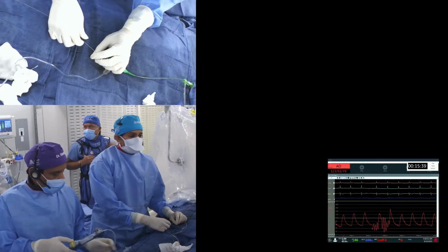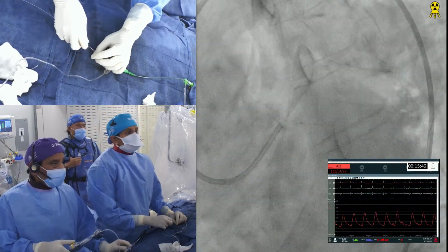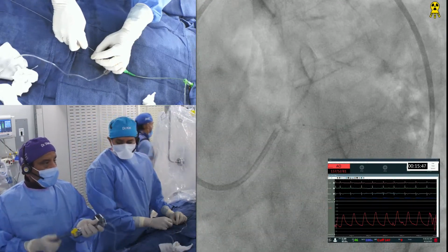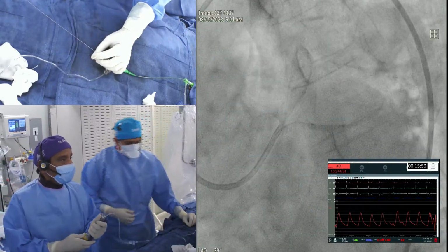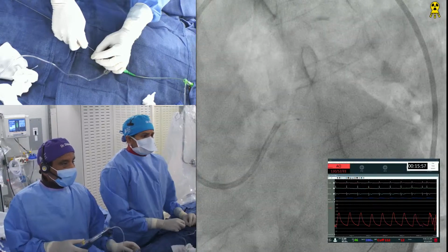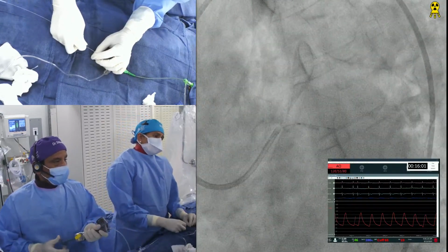Clearly. So as I said, another teaching point: a partial proximal atherectomy concept. Don't worry, in an angulated, long lesion you have done quite a bit. Don't worry that you have not done the full circle. The purpose is that you have cut the internal elastic lamina, and now your balloon will do the job. So you want what, 3.0?